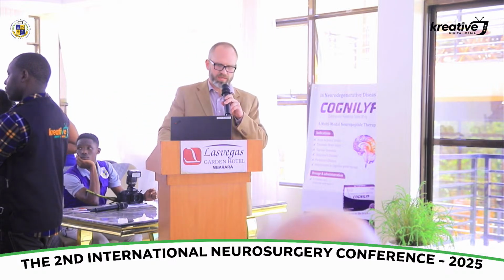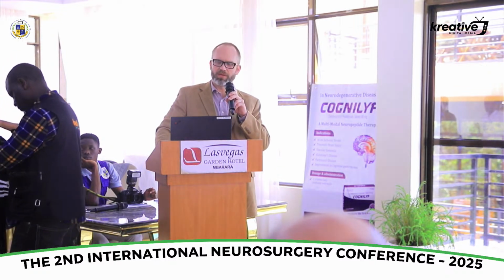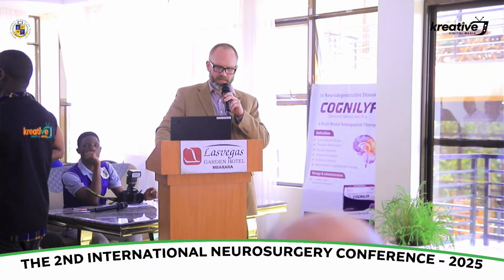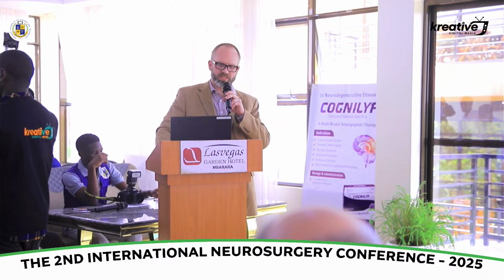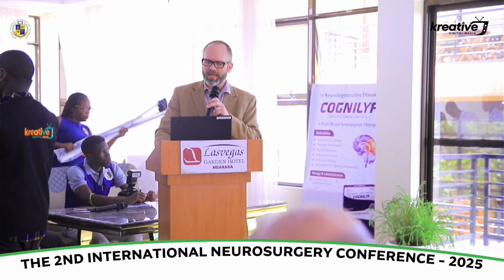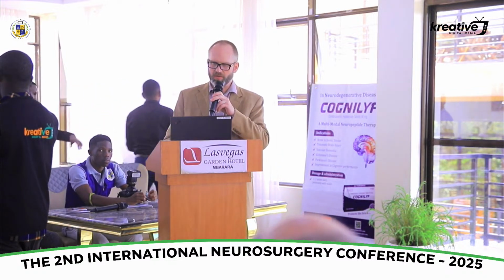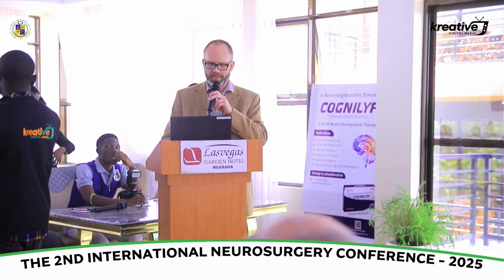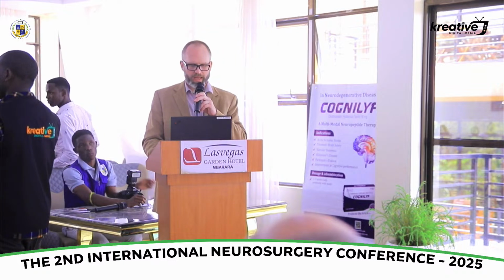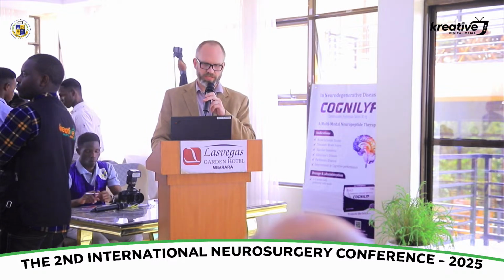First use of B-mode ultrasound where you could actually see an image was in 1978. It was for a spinal cord tumor. And brain and spinal cord parenchyma have viscoelastic features that permit exceptional ultrasound propagation. When you're open at surgery, you don't have attenuation of the ultrasound beam by skin or connective tissue or bone. And it's real-time information, so you get a superb temporal and spatial resolution.